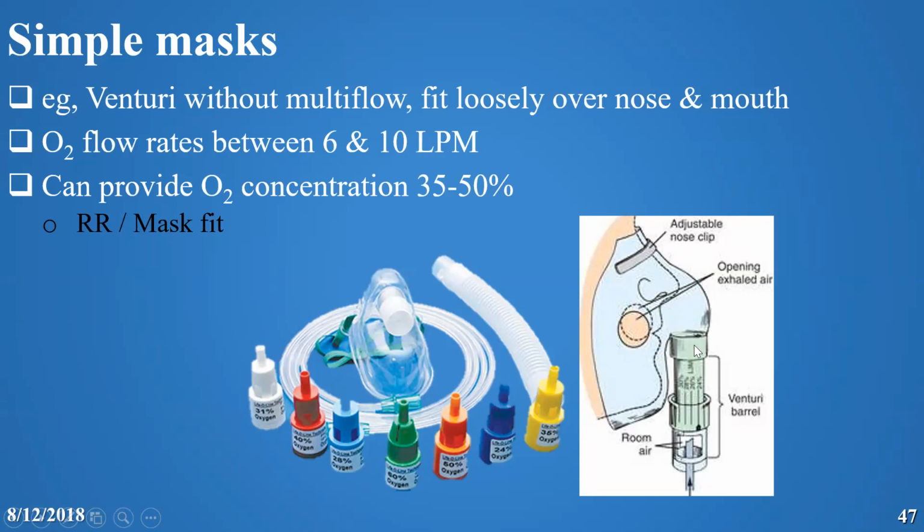Okay, so that's what Venturi is. The simple mask with a connection to the oxygen port where the flow can be changed. Or we can use an unchangeable connection or port, but different flow, so it's called multiple flow. They're the same, but in this one we change the flow, and in this one we replace each port by its color. So it only changes the flow, and because it's connected to the oxygen without a blender, the percentage of oxygen changes according to the flow.